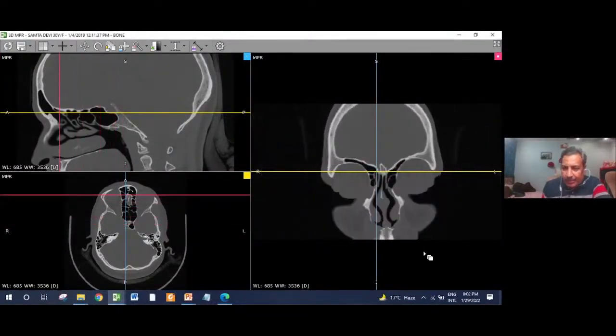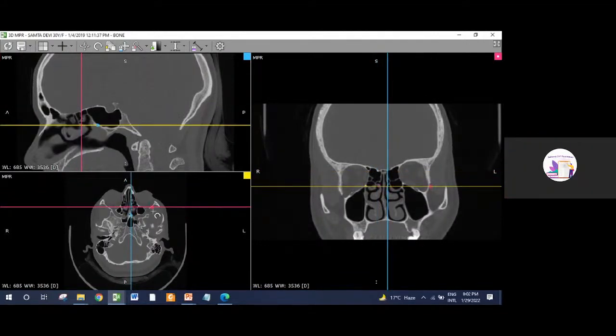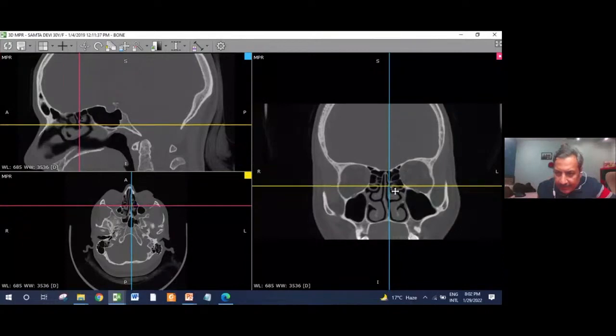What I'm supposed to do, some annotation request is coming again and again. Decline, sir. Decline. Okay. Now see, this is my middle turbinate which is turning.